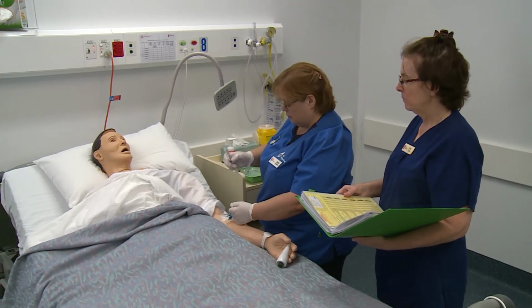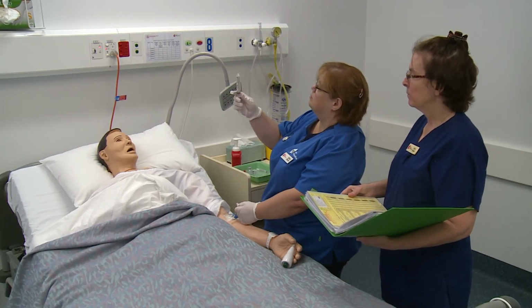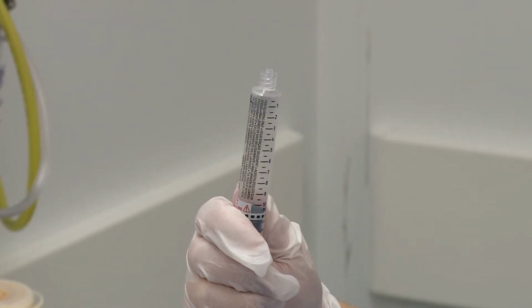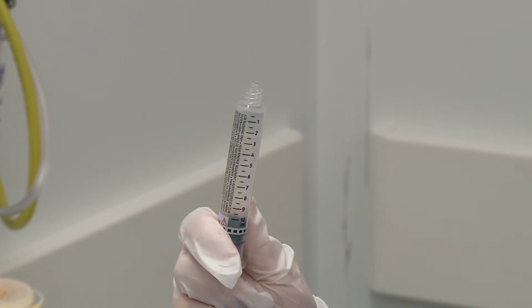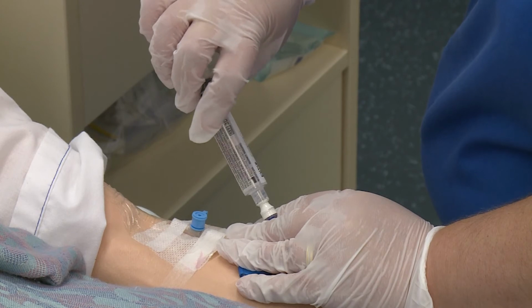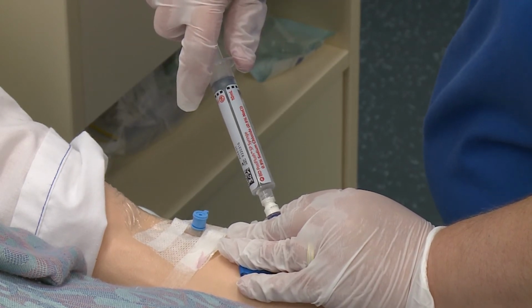Take off the cap. Make sure my key parts are protected. I'm going to get rid of my air bubble. Okay, and now I'm going to connect and flush over 30 seconds.